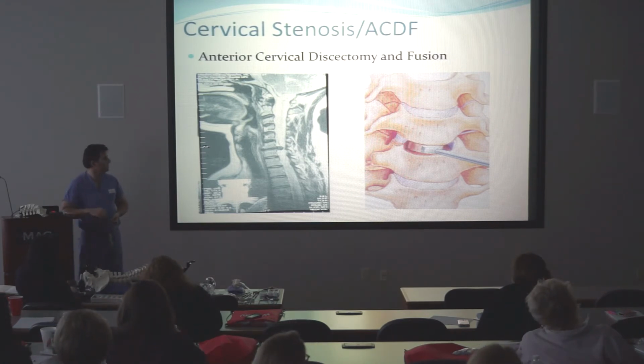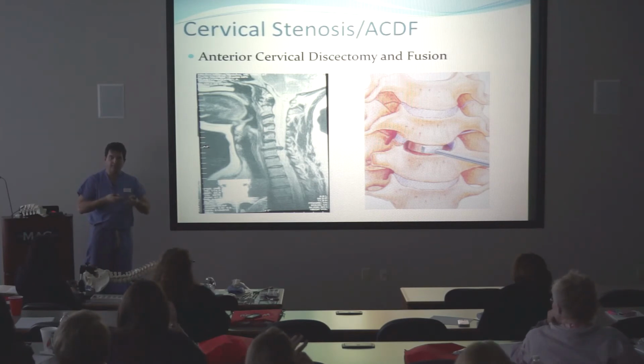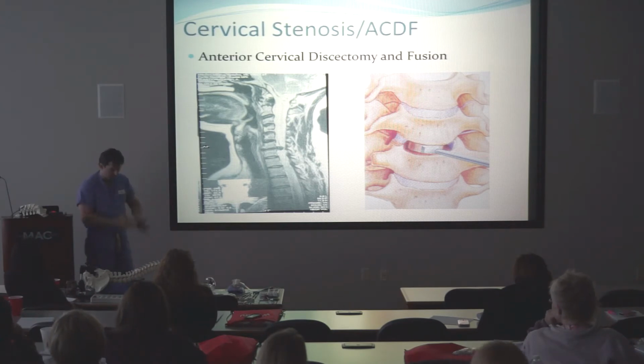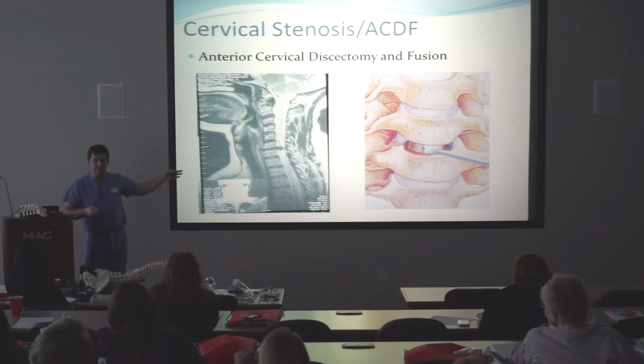Yeah, you clean all that off until you're at the spinal cord, and then you see it float back towards you as you're cleaning this disc out and the soft tissue away. When you look down into that crevice, you'll see the dura, the tube of fluid that holds the spinal fluid and the cord inside, actually balloon up into your crevice because it's been decompressed. That bulging lets you know you have it. And the dura is actually light blue, so you can tell it's not disc. That's how you know the difference between the dural tube and the actual disc material or the ligaments.